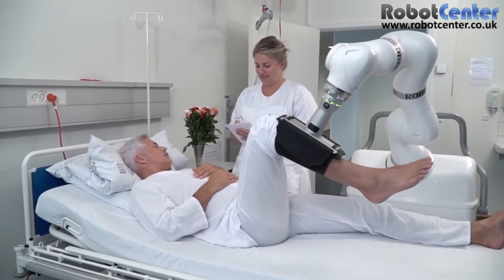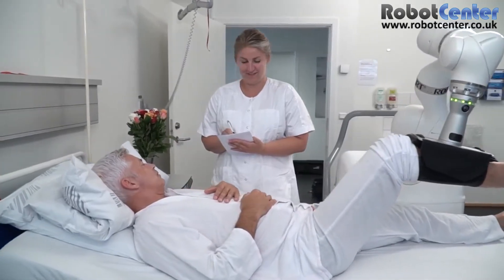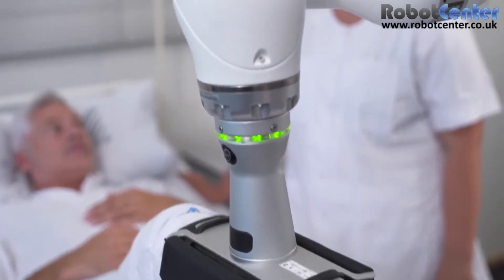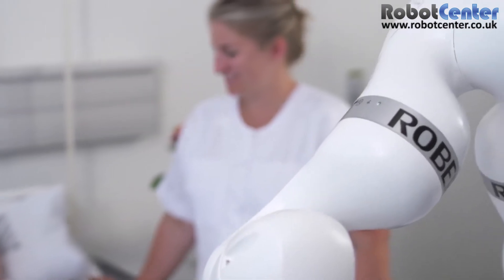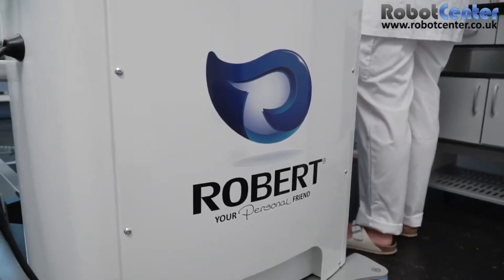Currently, the therapist must perform such exercises manually by repeating activation of the patient's leg into, for instance, flexion, abduction, or rotation. Having Robert as her assistant, the therapist will instead have time on her hands to carry out other tasks.